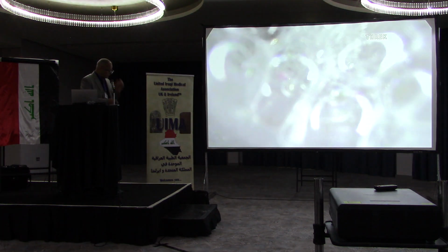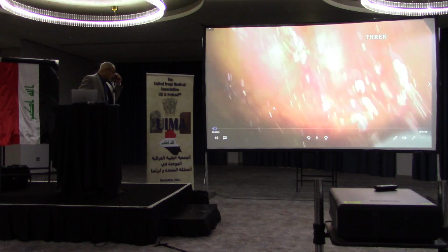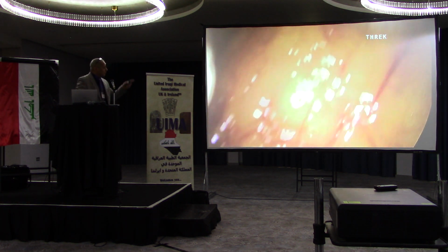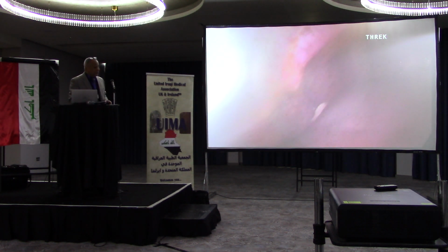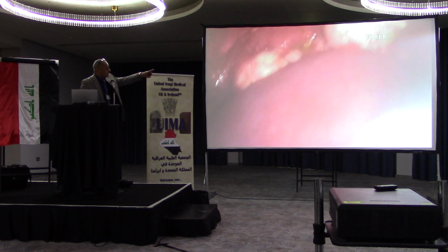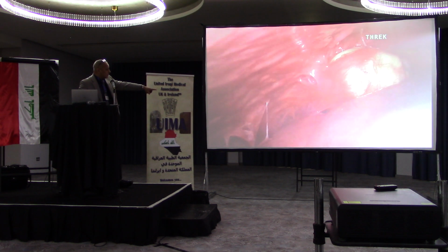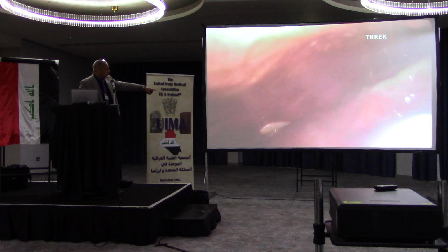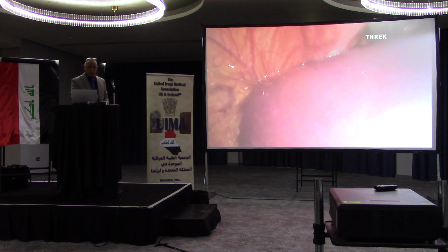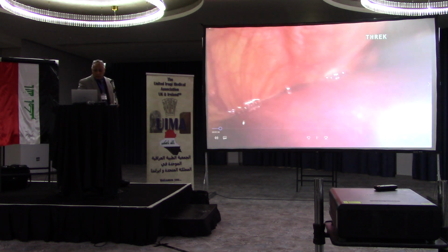Let's start with this video for this patient, a 45-year-old female who presented with pain, and during investigation was found to have multiple hydatid cysts related to segments 7 and 8, and then along the diaphragm, in contact with the diaphragm, and the other one. The CT and ultrasound say 3, but I found 4, which is the most common finding: more than 1.